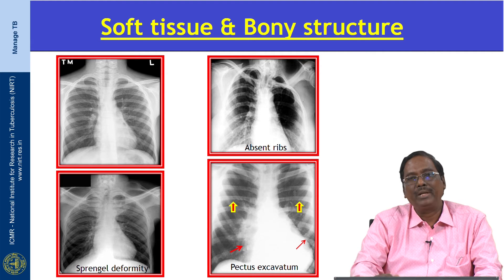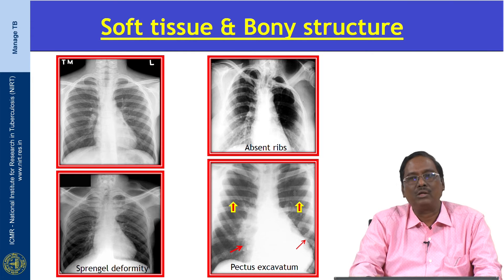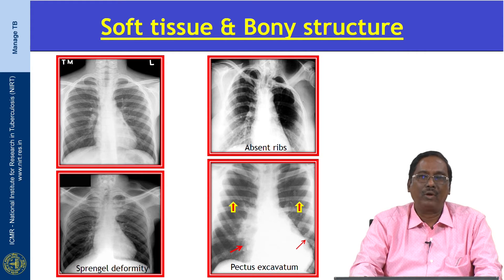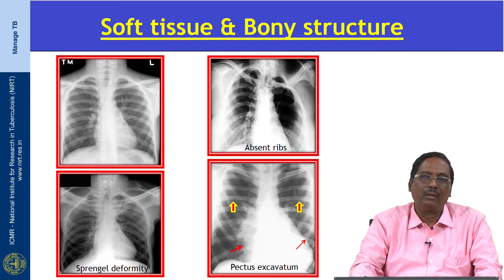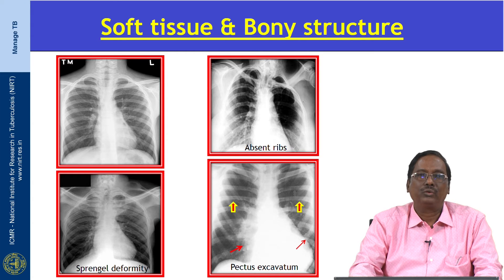After verifying the quality of the X-ray, we have to start interpreting the findings. First, we have to concentrate on the soft tissue and bony structures. We have to look for any bony abnormality, checking the ribs, clavicle, and scapula.